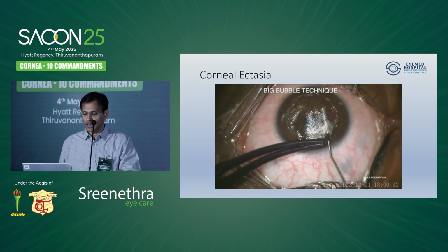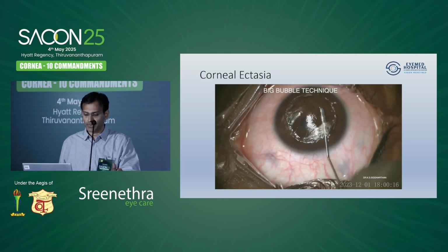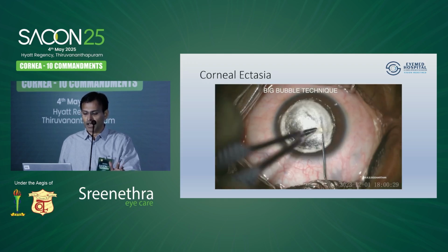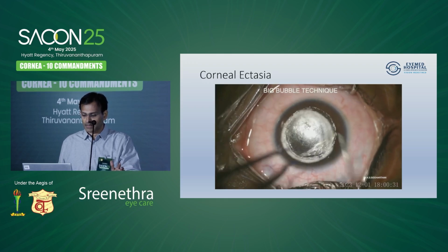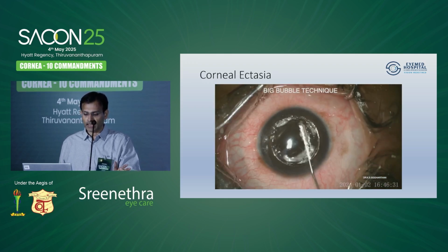You can see here, go inside, and then as one shot you should inject, like you should depress it down. You can see me nicely depressing it down and injecting in one shot, and a bubble forms. And this is one method. And the other thing is, there are many times you won't get a clear bubble like that.